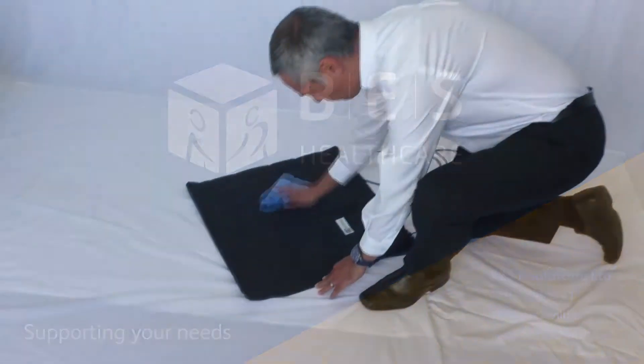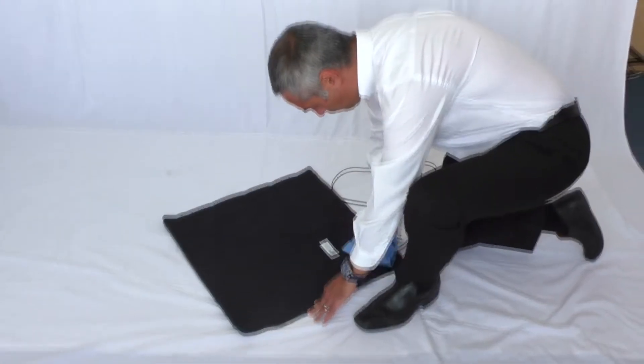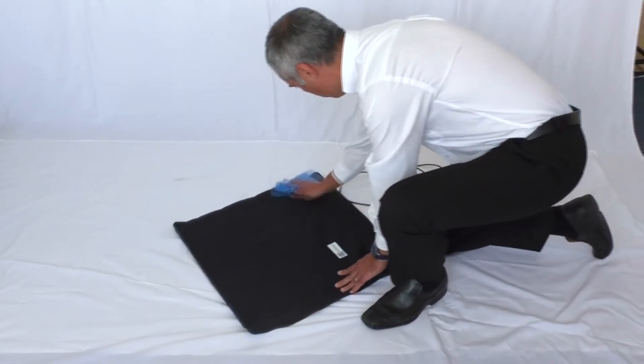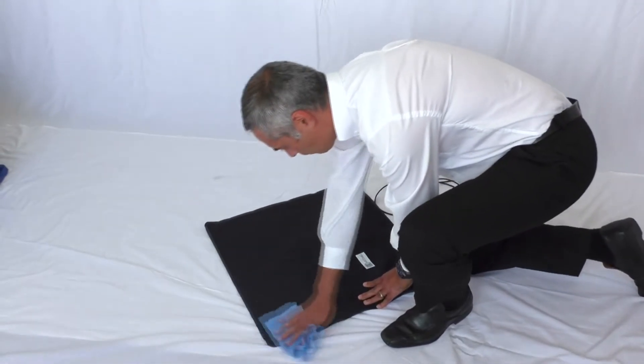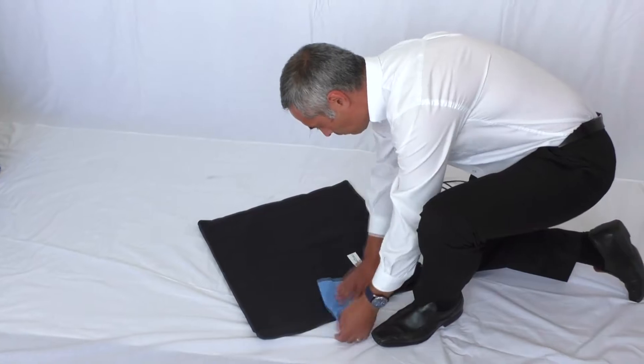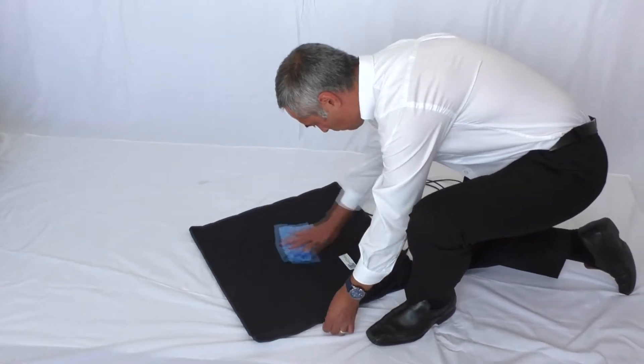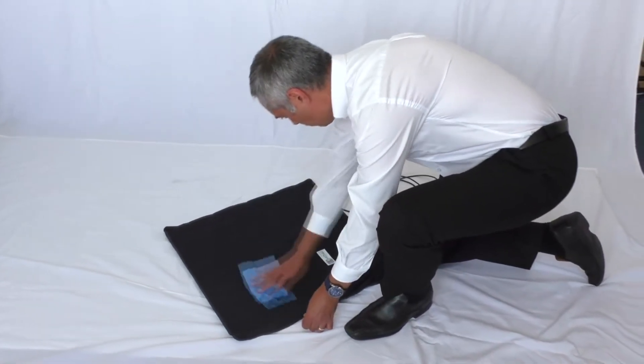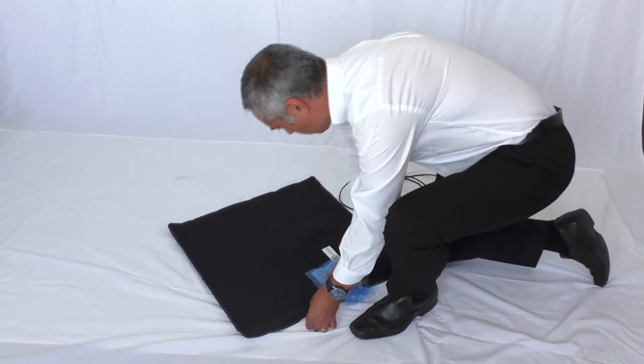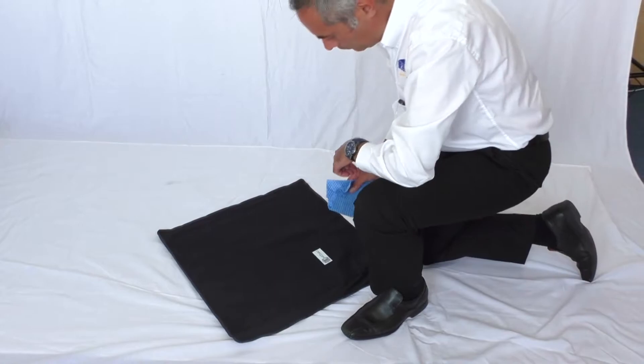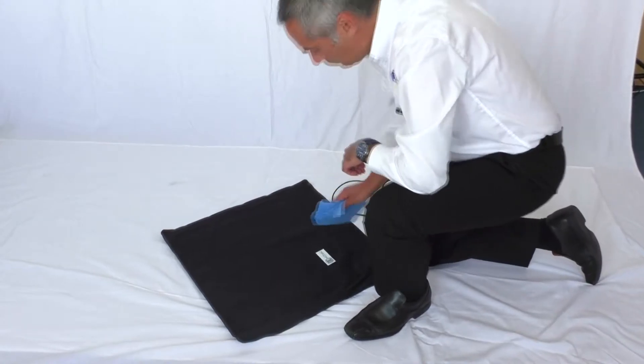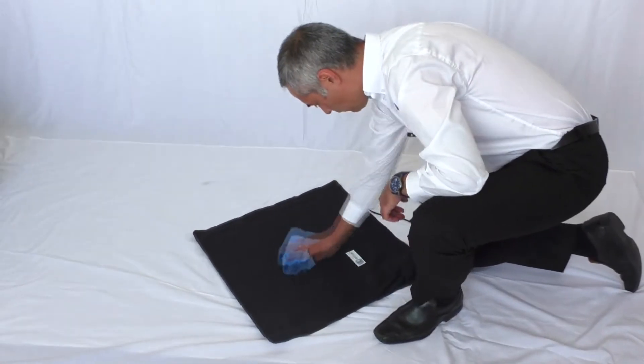Cleaning your mat. To clean the BodyTrak mat, wipe down with a damp cloth or with a mild alcohol-based cleaner. Keep the mat in its tube when not in use.